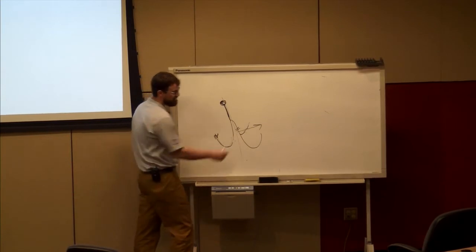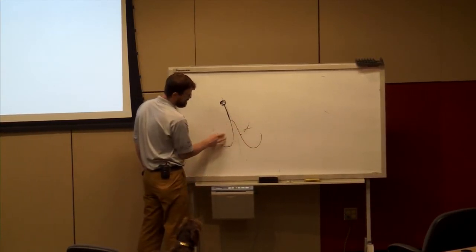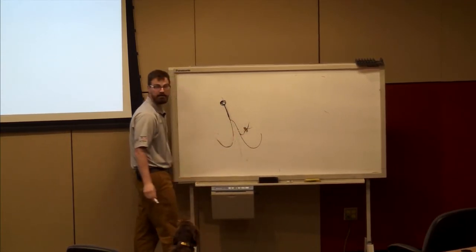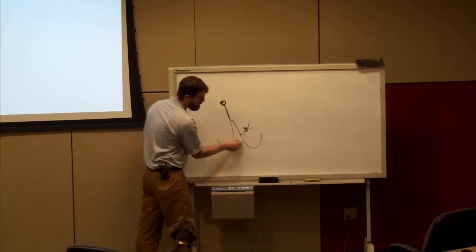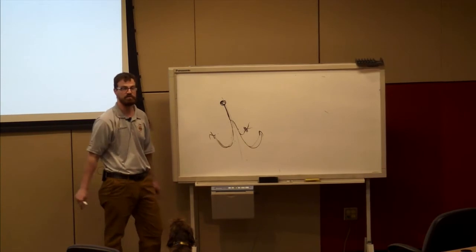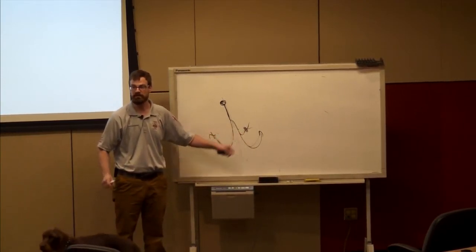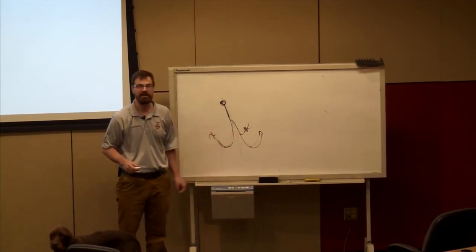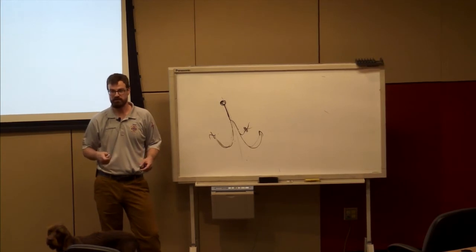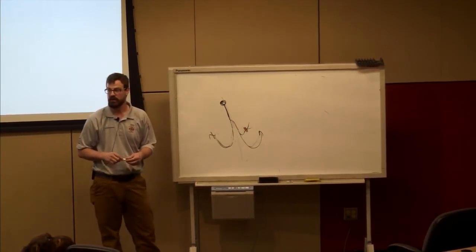If I just have a single unifascicular block on the left side, I still get rapid depolarization of both ventricles, so it stays narrow. Unifascicular blocks of left origin, posterior or anterior, actually result in an axis deviation, not a wide QRS, because I've altered the pathway of depolarization of that ventricle.